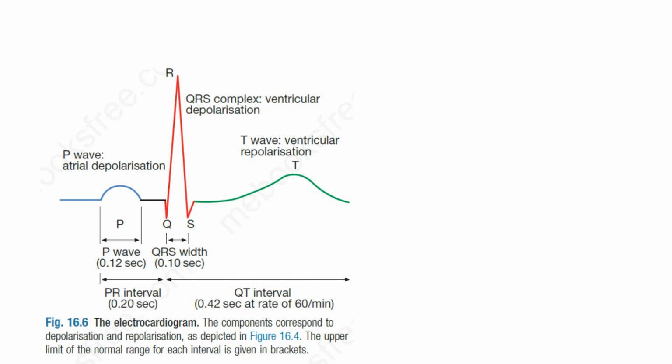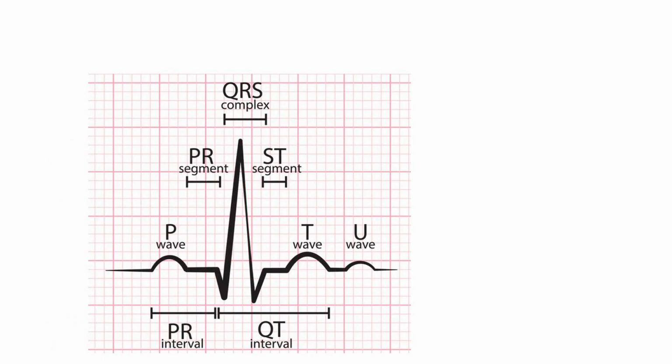Now ST segment. For ST segment we have to see another figure. This is ST segment. Just from end of QRS complex to the beginning of T wave.